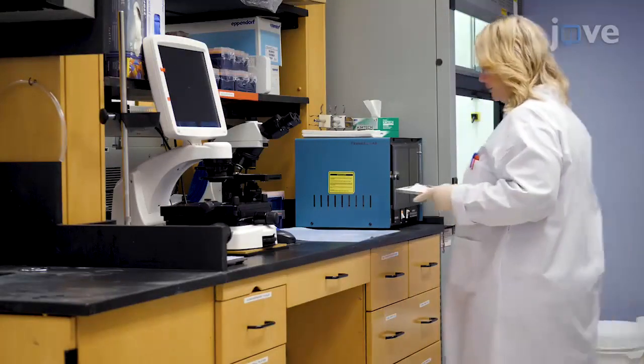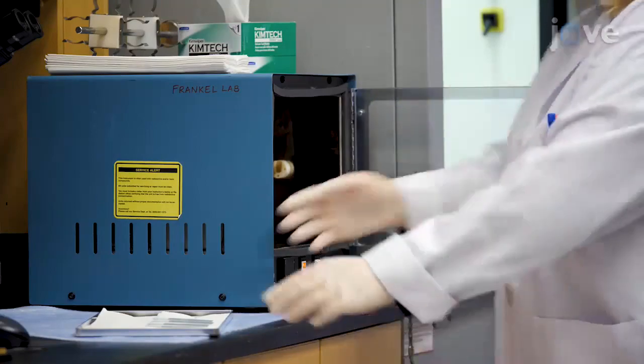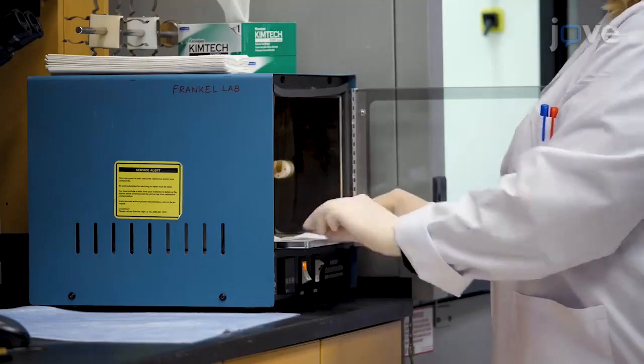Begin by de-paraffinizing and rehydrating the slides. Lay them in the hybridization oven with tissue side up and bake them at 60 degrees Celsius for an hour.